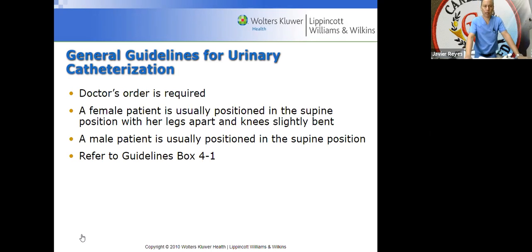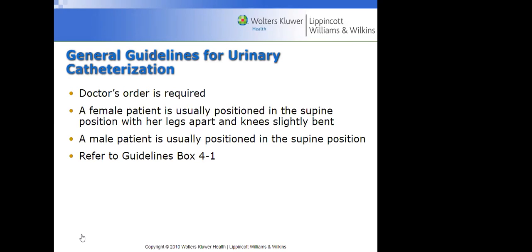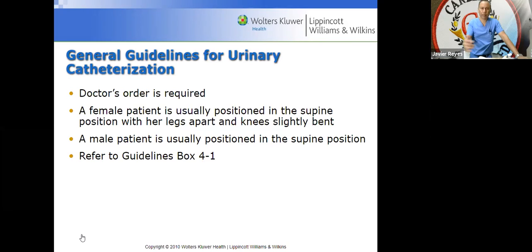On males, the only challenge that you have is if the male has a very small penis. Sure. Yes, I have a question. So when you're putting the catheter in, you have to get urine back out or you're not in the right place. Correct. Once you see urine come out, you want to push it a little bit more, and then you want to inflate the balloon so it doesn't slip out.